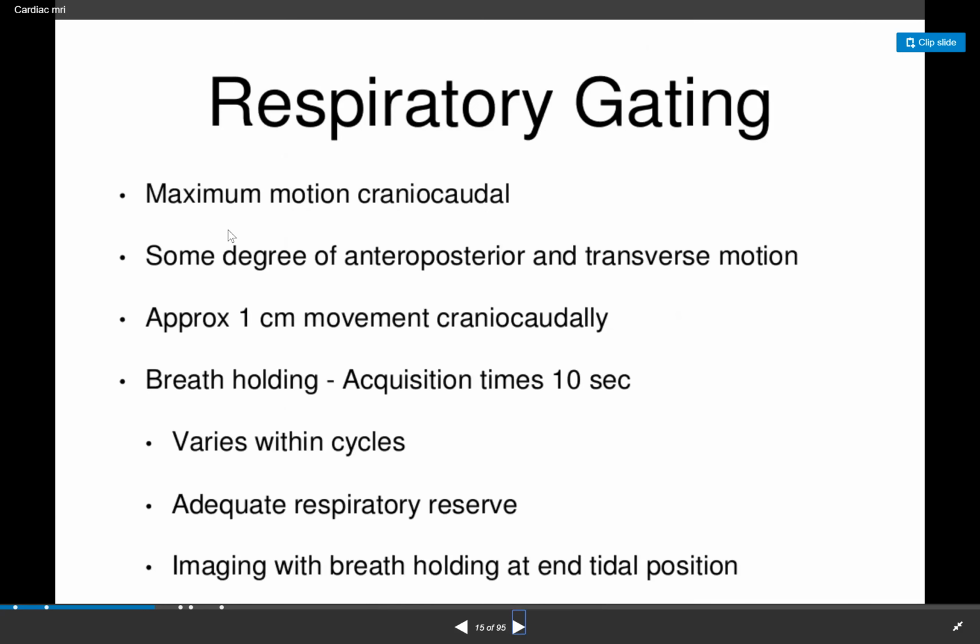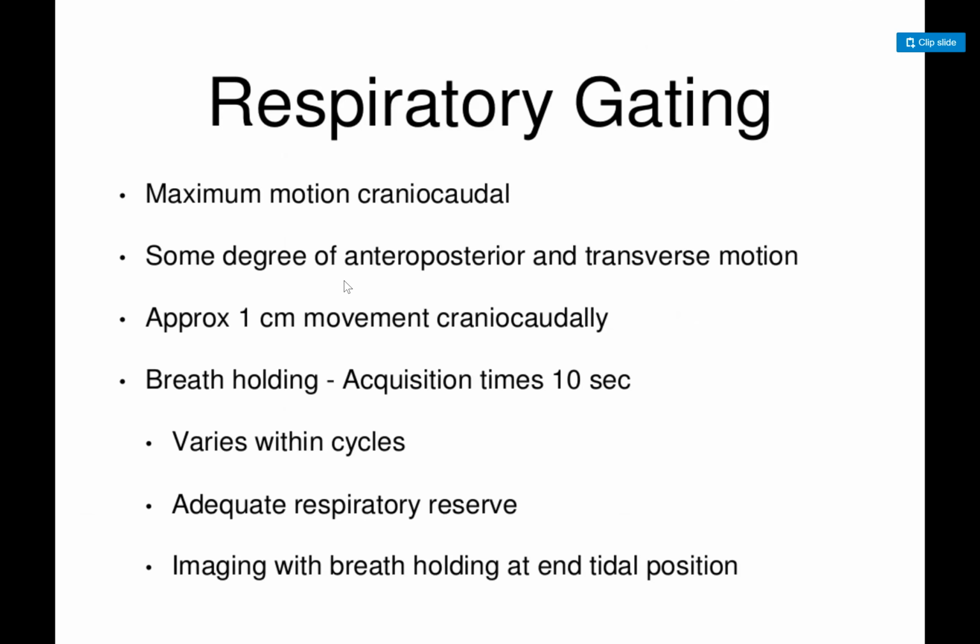Now, there's another form of gating, which is respiratory gating, that is also very important in MRI. In CT scan, you just take a breath and the image is done already. While in the MRI, we obtain images in expiration most of the times. You can do inspiration as well, especially in patients with a pacemaker, because the pacemaker will move up, but otherwise we do all the images in expiration.